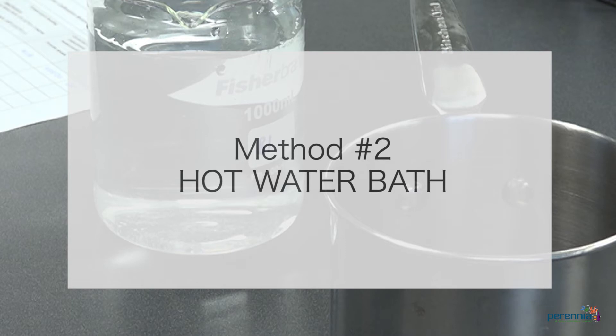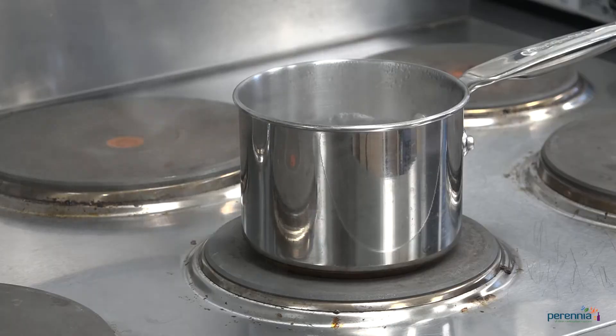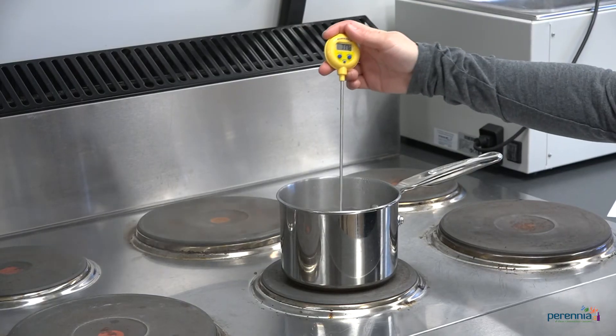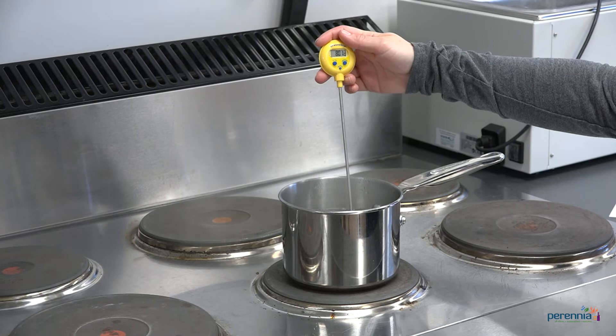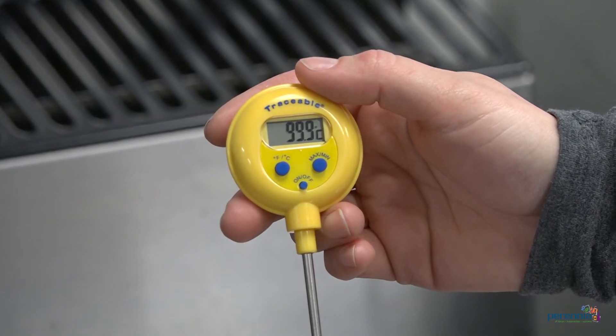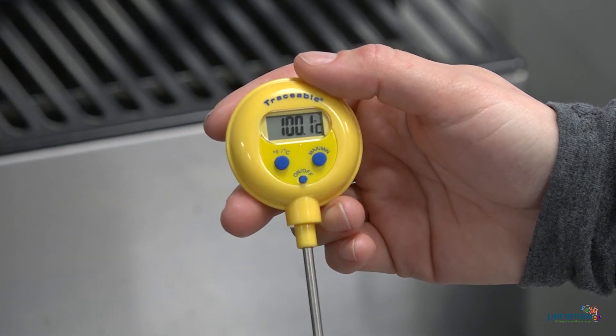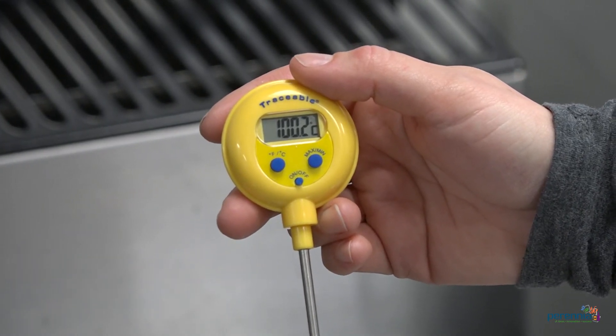The second method we will demonstrate is by using a hot water bath. Step one: fill a pot with distilled water and bring the water to a boil. Once the water has reached a rolling boil, step two is to place the thermometer into the water without touching the sides or bottom of the pot. Step three: read and record the temperature. The thermometer must read 100 degrees Celsius or 212 degrees Fahrenheit, plus or minus one degree.